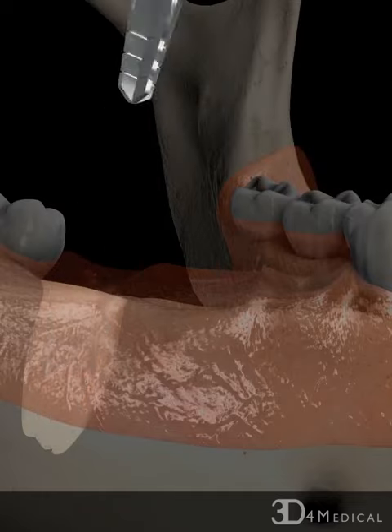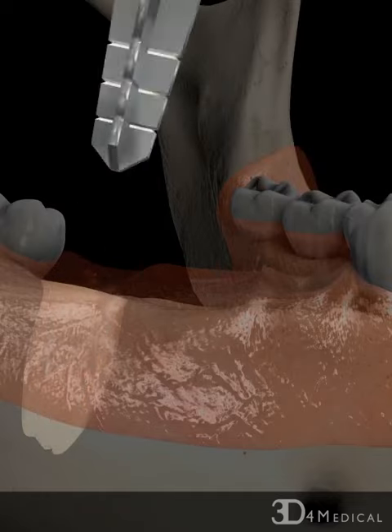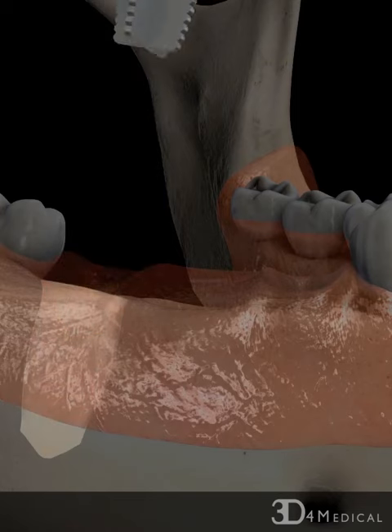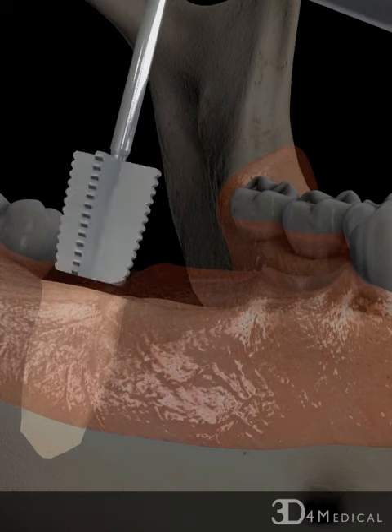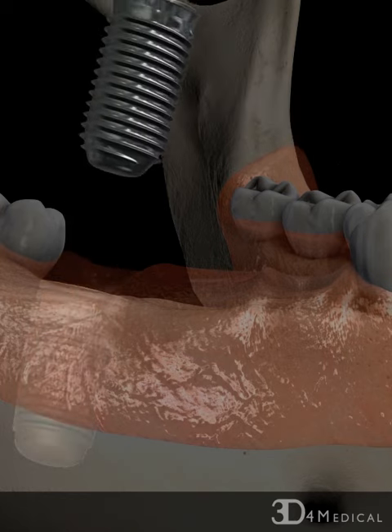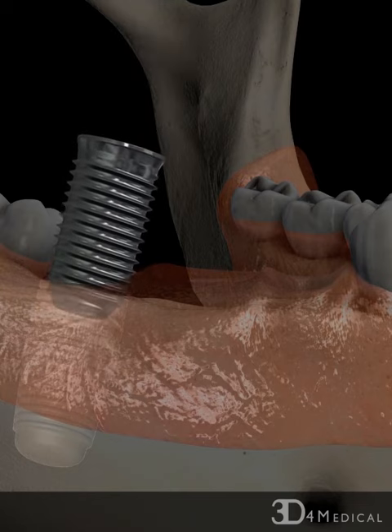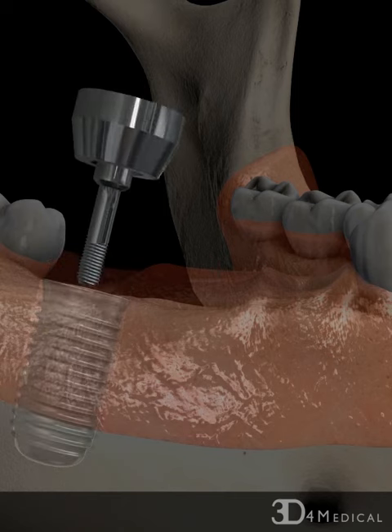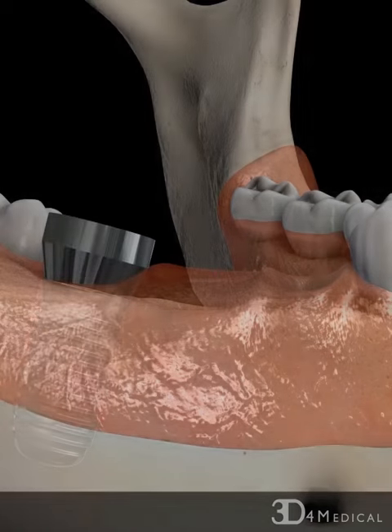Threads are then cut in the socket and the implant is inserted into the jawbone. A healing screw which projects above the gum line is inserted temporarily on top of the implant to prevent the gum tissue from closing over the implant while the tissues surrounding it heal.